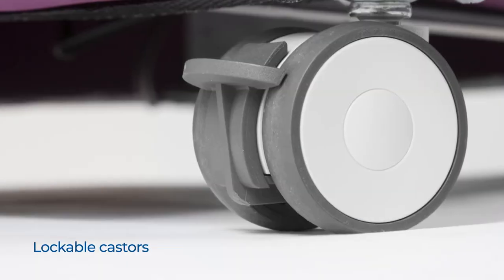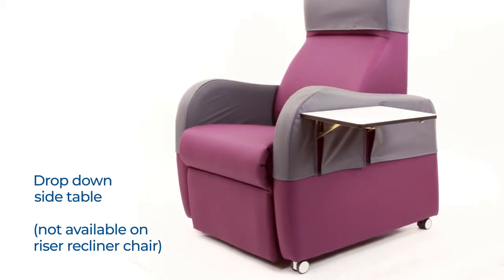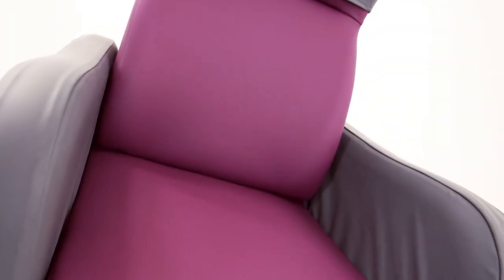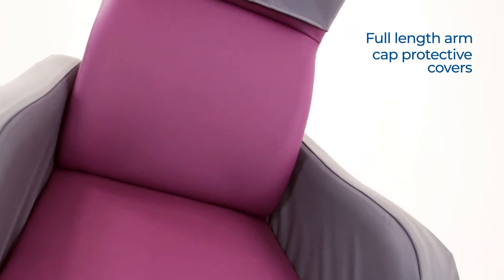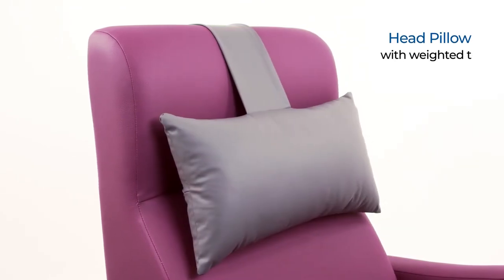Standard features include a posture-supporting backrest design and heavy duty lockable casters. Optional extras include a drop-down side table, full-length arm cap protective covers, head protector sleeve, head pillow and head roll, both with weighted tabs.